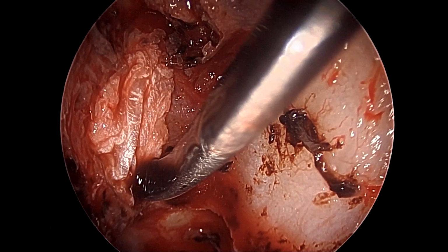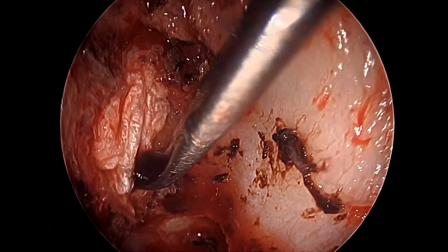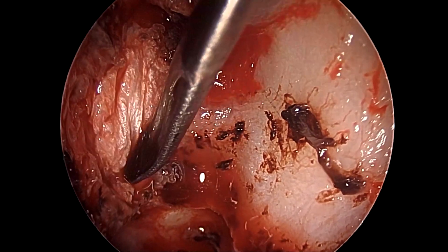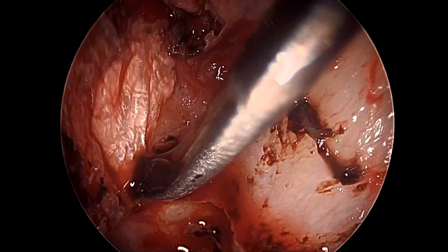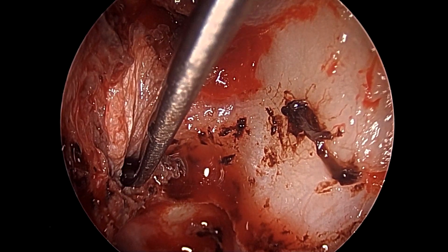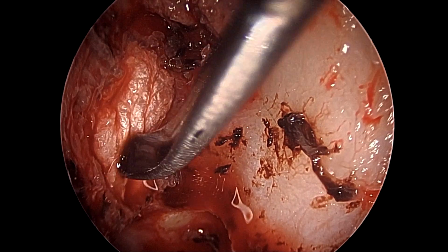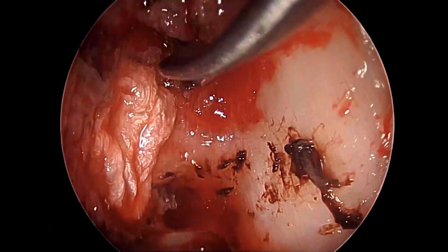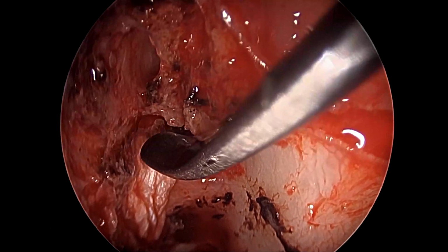As we see here, the fascia lata has been reasonably well insinuated between the layers of the dura and the bone, with just the final portions being done to confirm that it is inside all around and no part is left open, because whichever part is left open could become a site of a CSF leak.